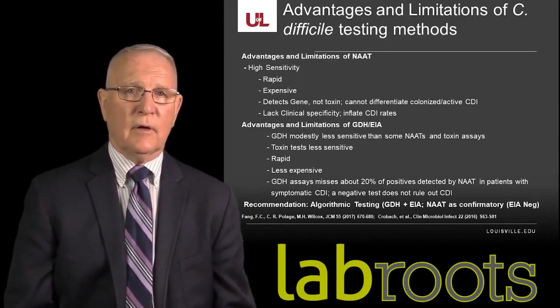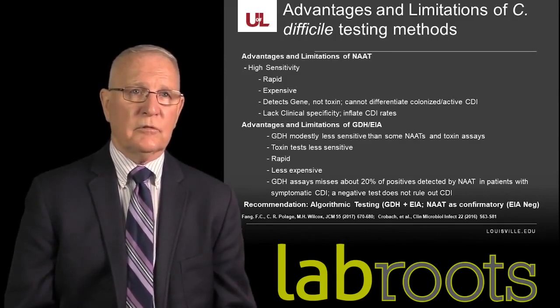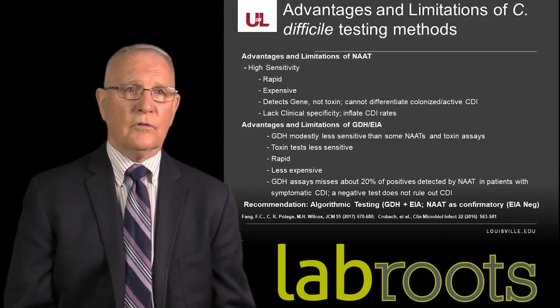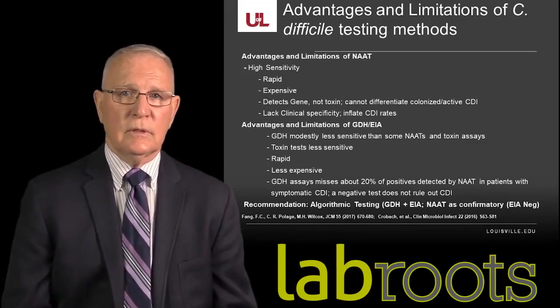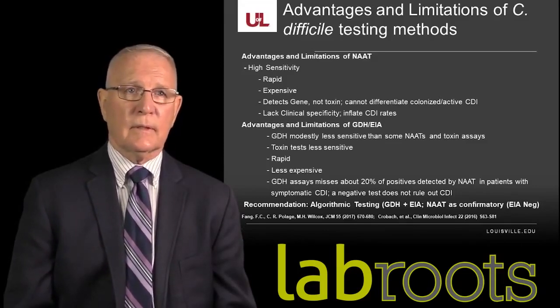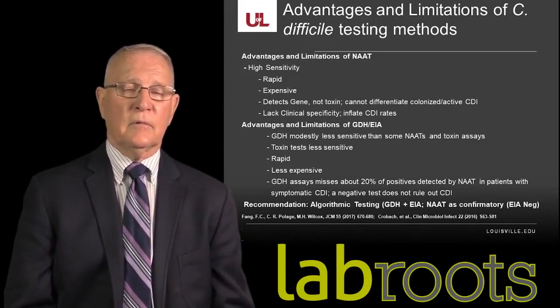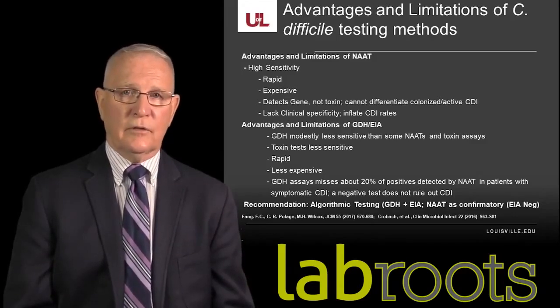Nucleic acid tests have a very high sensitivity, and as a result of the high sensitivity, it overcalls or increases the rates of C. difficile disease. Once again, remember that the molecular assays cannot differentiate between colonization and active CDI.